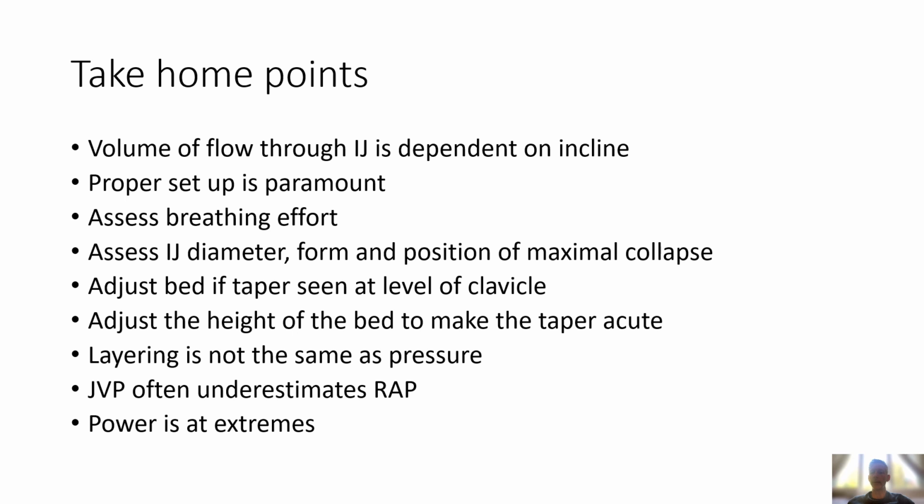Next, remember that the JVP often underestimates right atrial pressure, especially at higher pressures and a steeper incline. Consider the fact that the distance between the right atrium and the sternal angle generally increases as the incline of the head of the bed increases. Finally, the power of these data points lies at extremes.